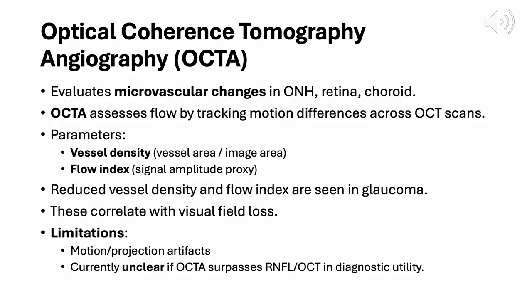In glaucoma, we often see reduced vessel density and flow, and studies show these vascular reductions can correlate with visual field loss. That said, OCTA still has its limitations. It's sensitive to motion and projection artifacts, and while promising, it remains uncertain whether OCTA outperforms conventional RNFL or structural OCT in clinical decision-making. So while OCTA adds another layer of insight, especially in research settings, it remains complementary to, rather than a replacement for, standard imaging.